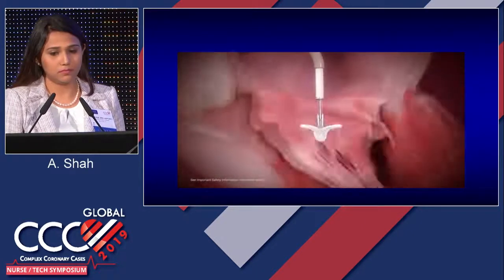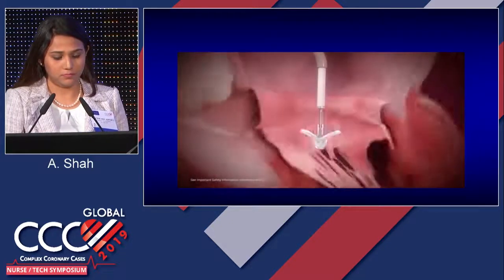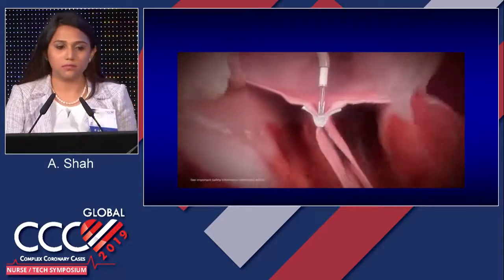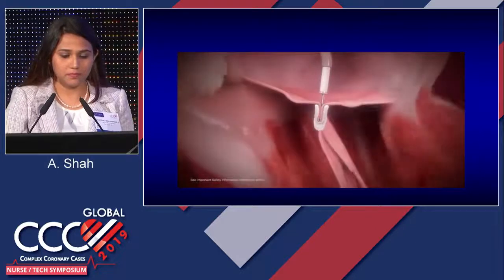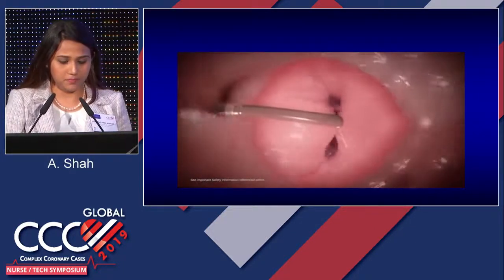The clip is advanced into the left ventricle below the valve leaflets and retracted to grasp the leaflets. MitraClip grippers are designed to drop firmly into the clip arms, securely capturing both leaflets. Once the arms are closed, they create a double orifice within the mitral valve.